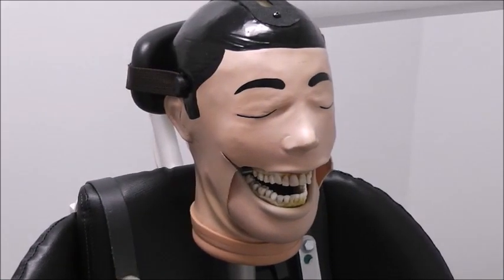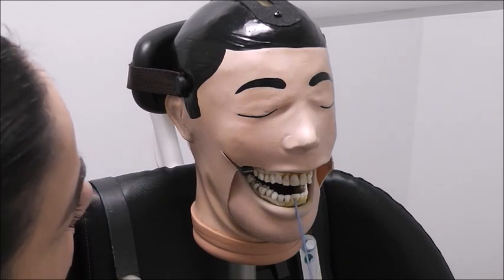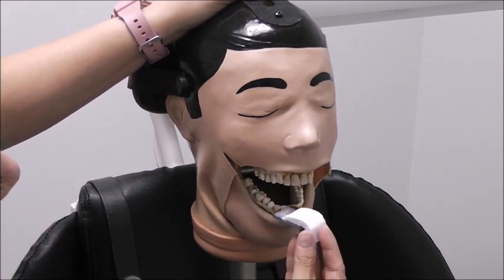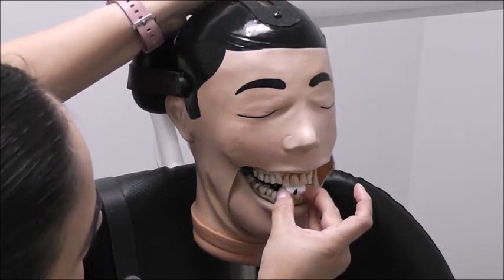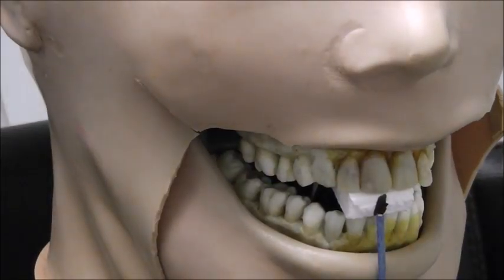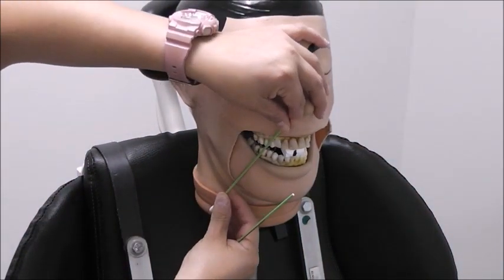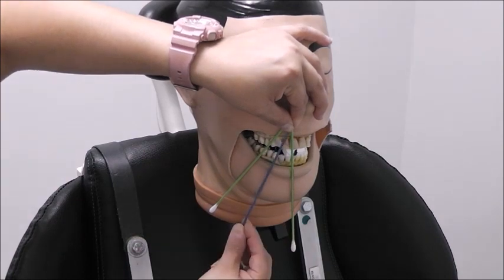We've done the maxillaries; now I'm going to show you the demonstration of the lowers. First is the incisors — place the marker between number 24 and 25 at the incisal edge. Move the tongue out of the way, place the bite block in the center of number 24 and 25, bring it as close to the teeth as possible, and close it gently. Verify that your marker is between 24 and 25 in the interproximal. Now find the bisecting angle: orientation of the plate, the long axis of the incisors — that forms a triangle, cut the triangle in half, and that half is our bisecting angle.